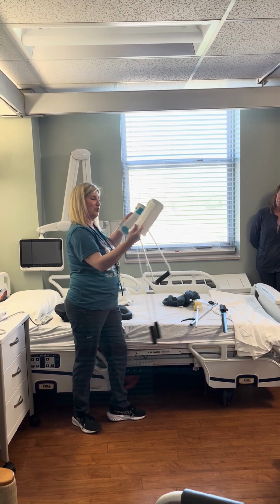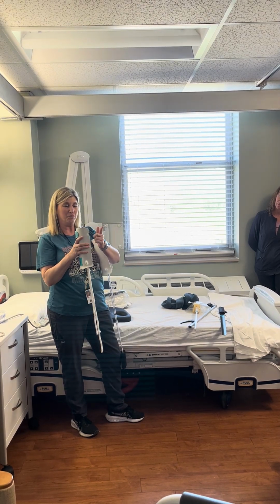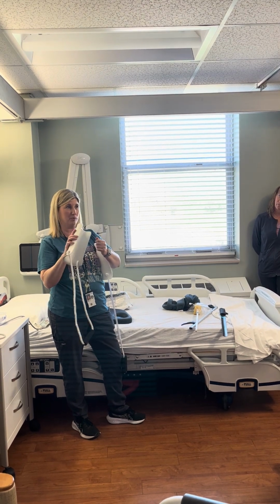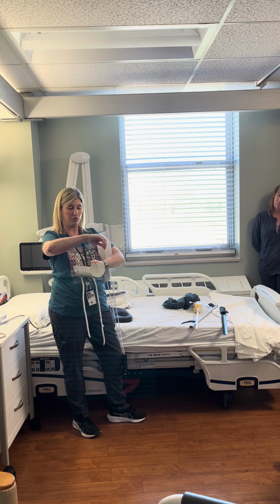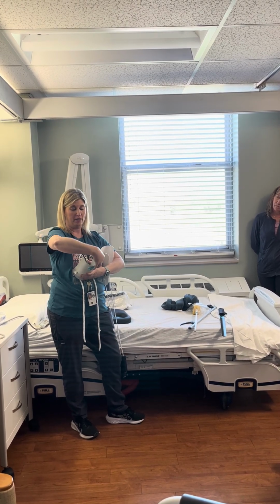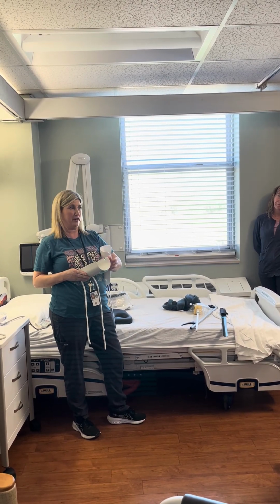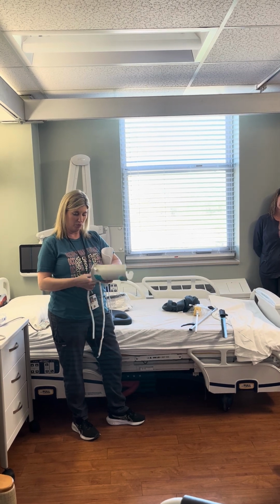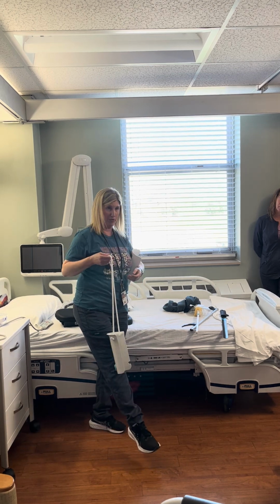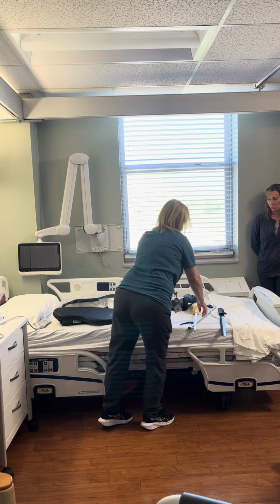Sock pullers, we've got two different types. We do give these notched ones out once in a while. So if you ever have any questions about how to use these, just let us know, because this is not something we give out a whole lot. But typically, if it's for one-handed, they're going to hook their sock into that notch and then bring it around with one hand. Then they throw that down, stick their foot in, and pull it right up over the heel. So, if you have questions on that one, just call OT.